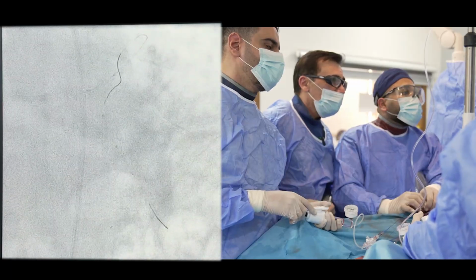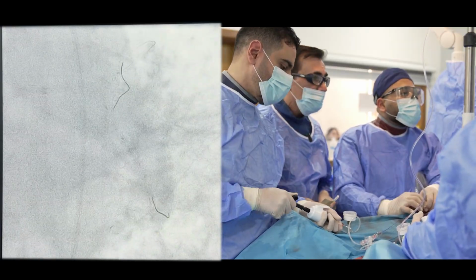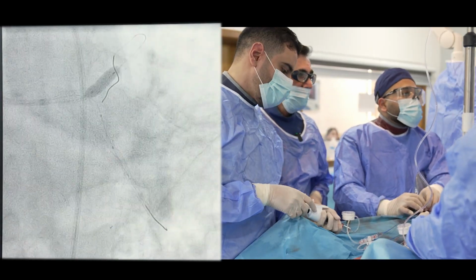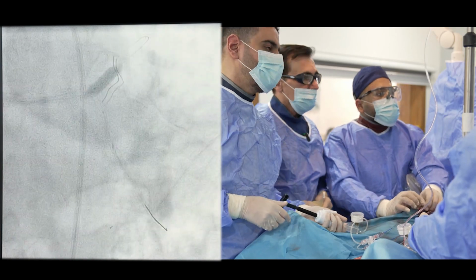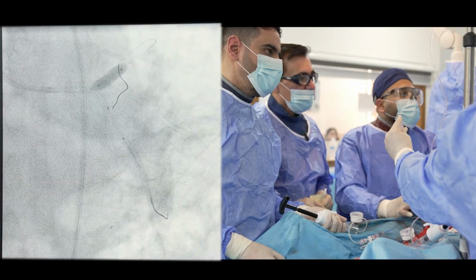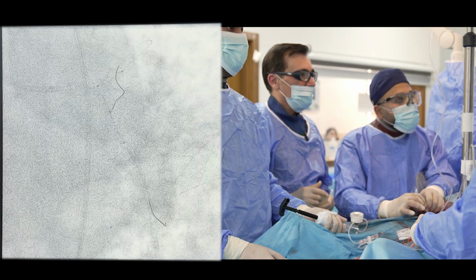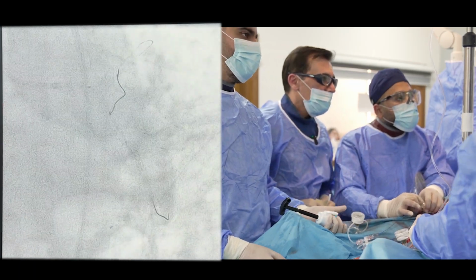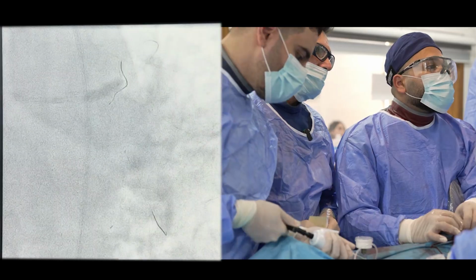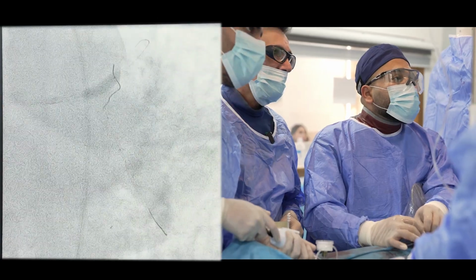Enough. Okay, go. The normal pressure is 10. Go to 16. 10. 16. Off. Pull it back to the bifurcation. This balloon takes a long time to deflate. Okay, pull it back a little. Okay, go to 10. Wait. 12. 16. Off.